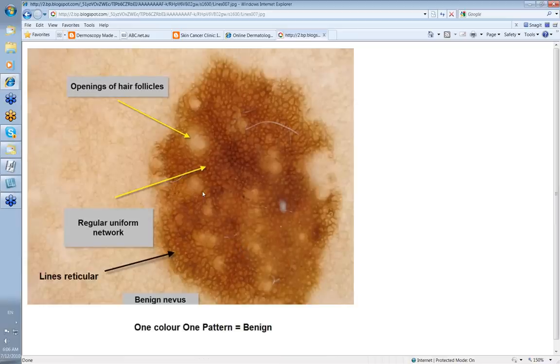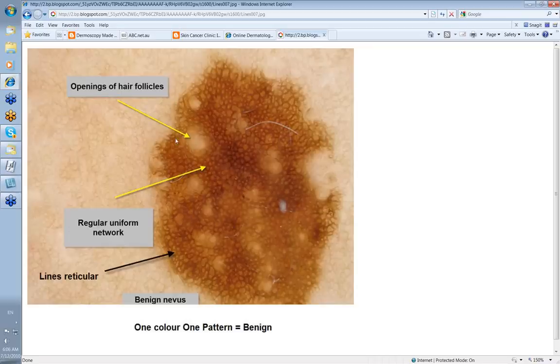In contrast, here also are lines reticular, but here you've got one color and one pattern, so it's a benign lesion. You've got a pretty uniform network. The areas that are missing are the openings of hair follicles, and this is the pattern of lines reticular in a benign nevus.